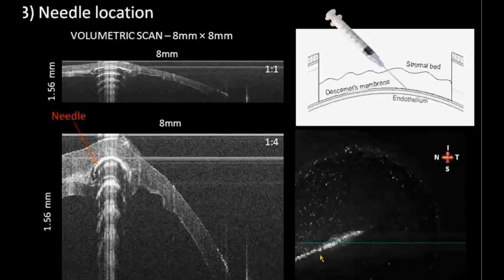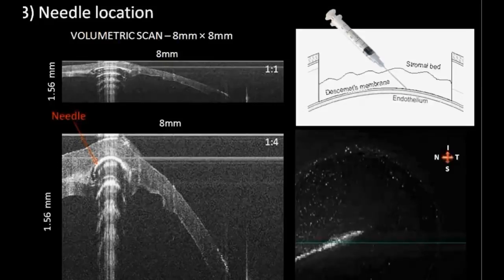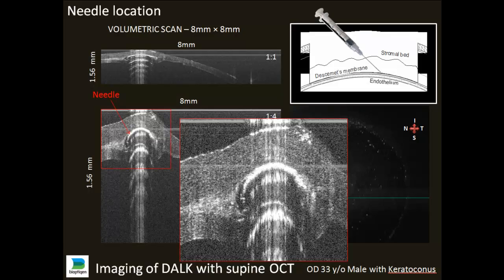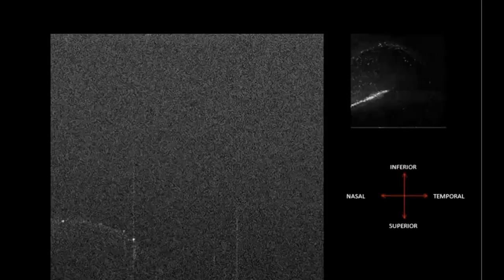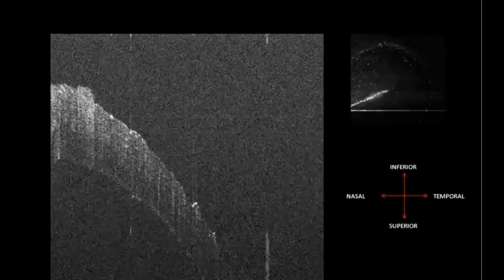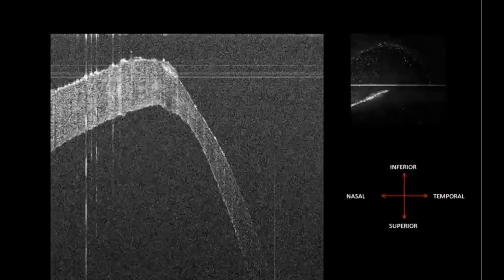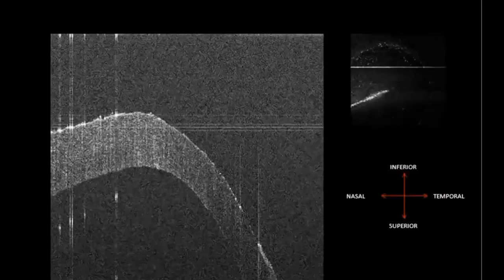This is the tricky part of the DALK surgery — what I call the blind part — where a needle is introduced into the residual 192 microns of stroma. The goal is to insert the tip of the needle just pre-Descemet's membrane without perforating through, then inject air to get a detachment of Descemet's membrane and endothelium. This part is quite delicate and somewhat blind, so wouldn't it be nice to have an imaging modality intraoperatively to assist us? We're studying this under IRB approval with the Bioptigen device.